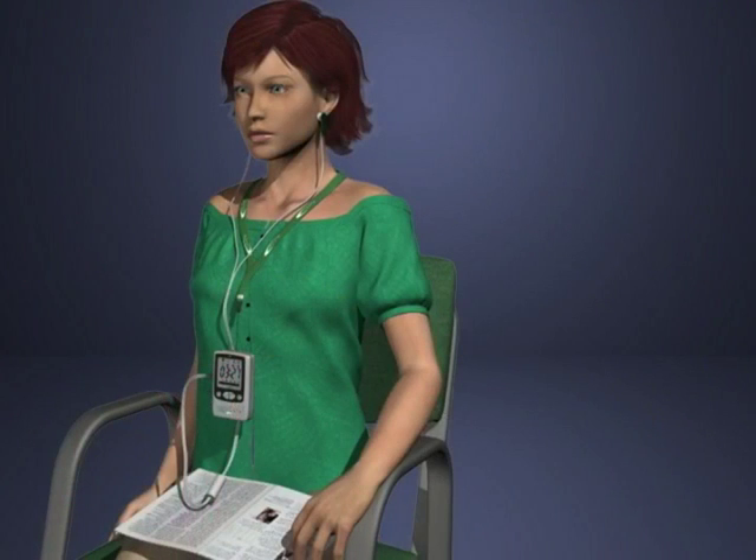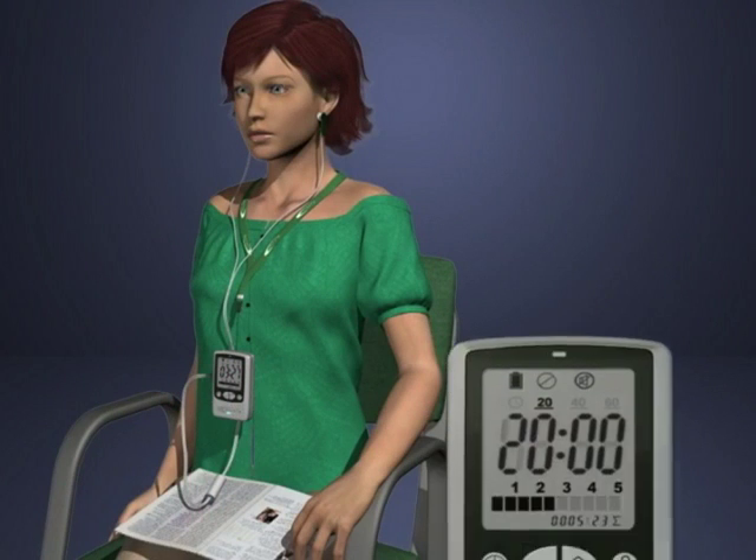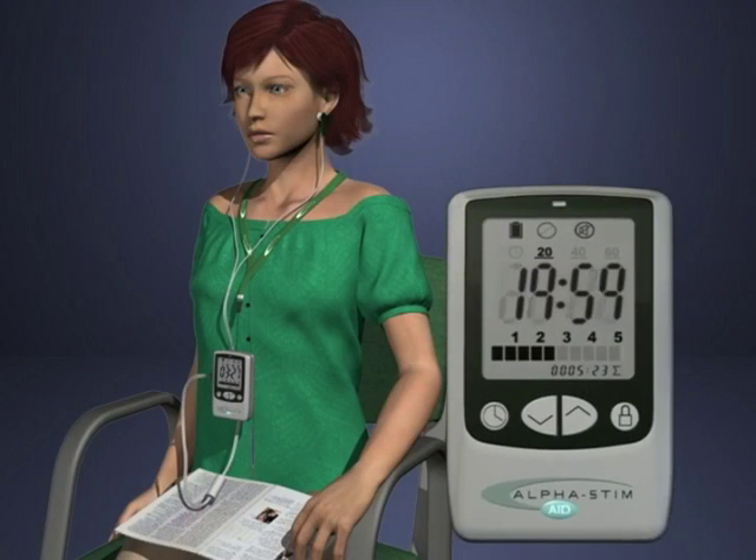Relax, sit or lie down, and let the Alpha-Stim relax you. You may also read, work at a desk, or watch television. Do not attempt to drive or operate dangerous tools or machinery during treatment.